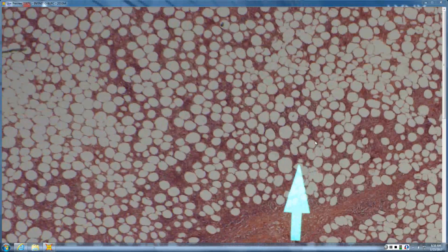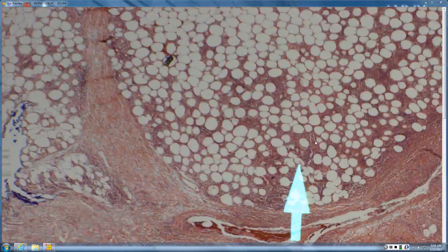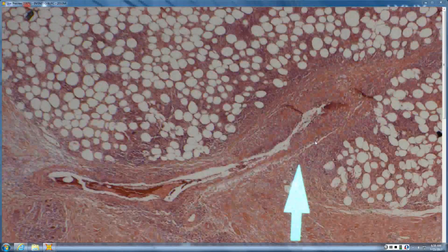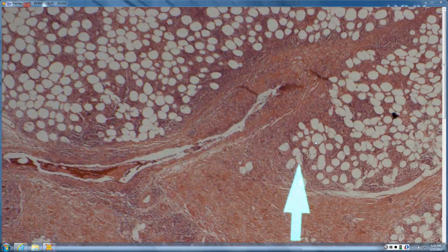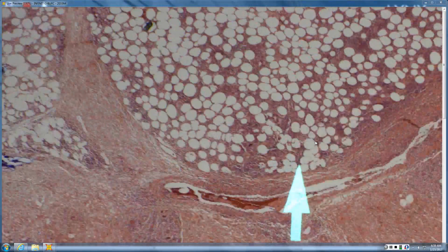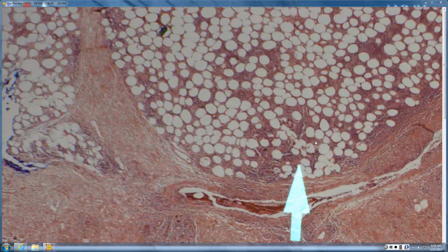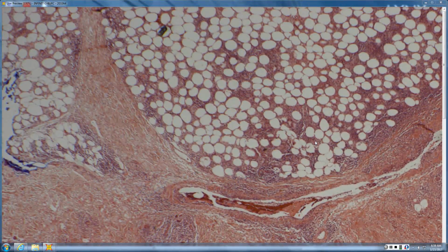So this one I think is a little bit more challenging. So looking at it at scan, you do have some dermal infiltrate, like we talked about. You want to look at that and see if it's helpful. This one, in contrast to that first one we saw, right? The first one was really very classic for lupus with that tight kind of perivascular lymphocytic inflammation. This one, at scan, it's not quite as dense. There's probably some histiocytes mixed in there. It's not really a classic scan diagnosis for lupus.